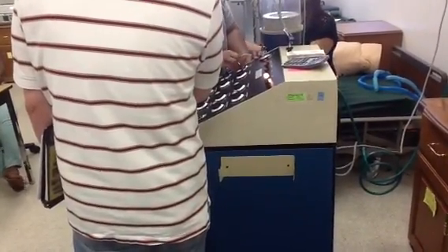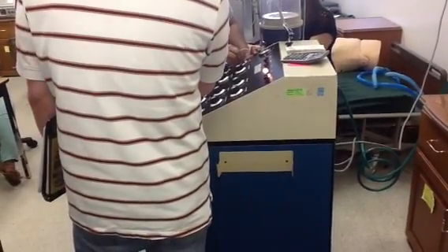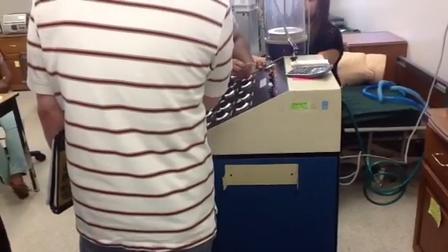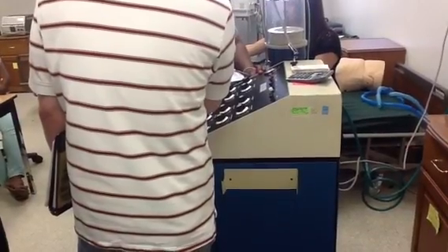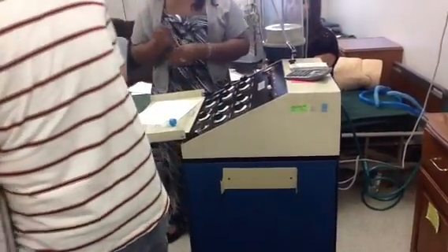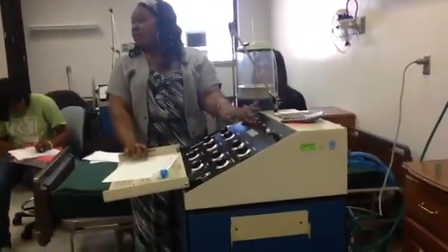About 3 now, so I need to increase it a little bit more. Okay. The sensitivity knob is not very sensitive. So, like I said, you notice the patient's breath when the assist light comes on.